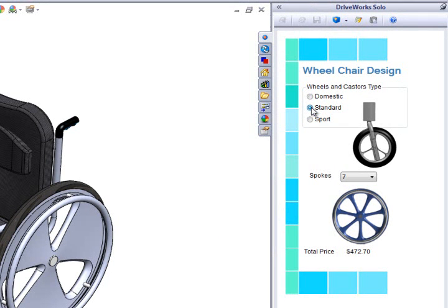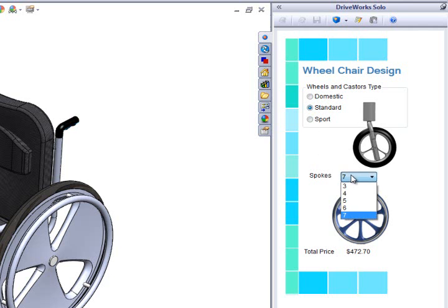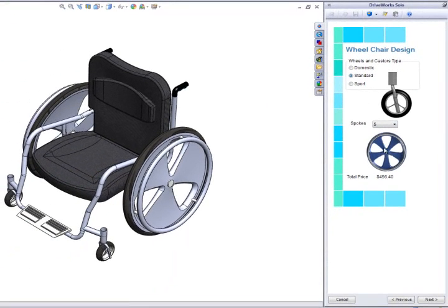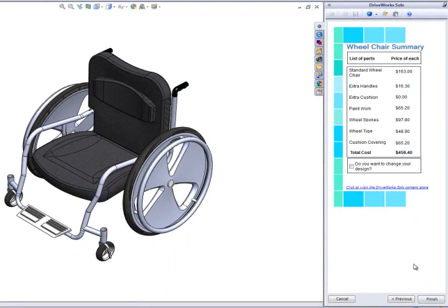DriveWorks Solo supports the use of transparent images. This means that images can be layered on top of other images and other controls, and that the overall look and feel of the form can be much more professional and visually appealing. I am going to select the number of spokes that we require on the wheel and move on.